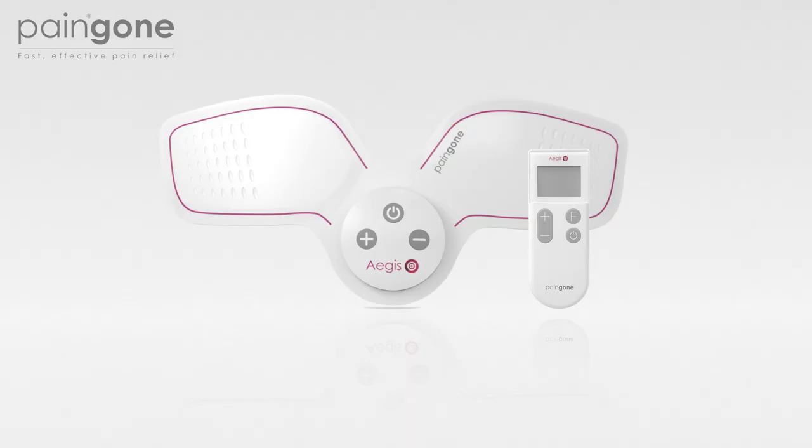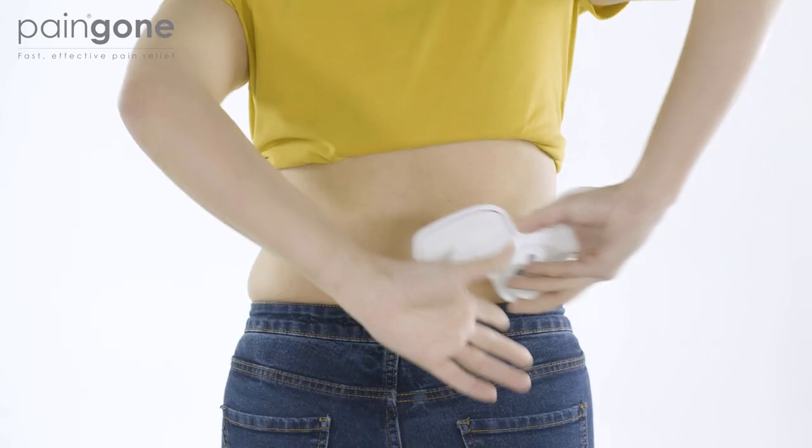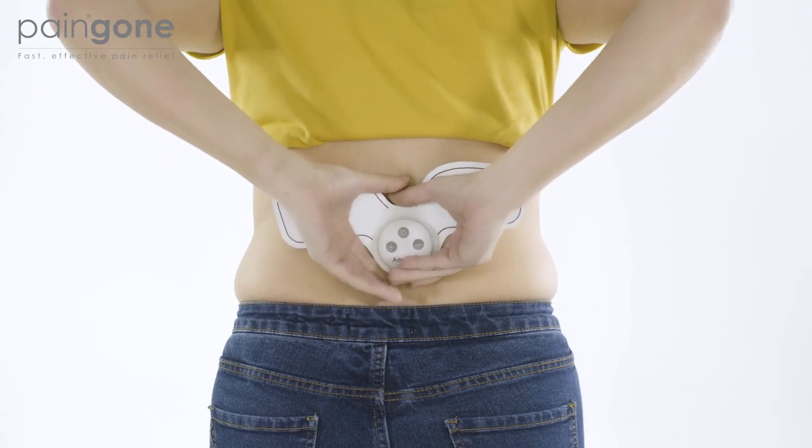Now press the power button on the device and on the remote control. Two beeps will sound indicating that the device and remote are paired. Apply the device to the desired area of the back.